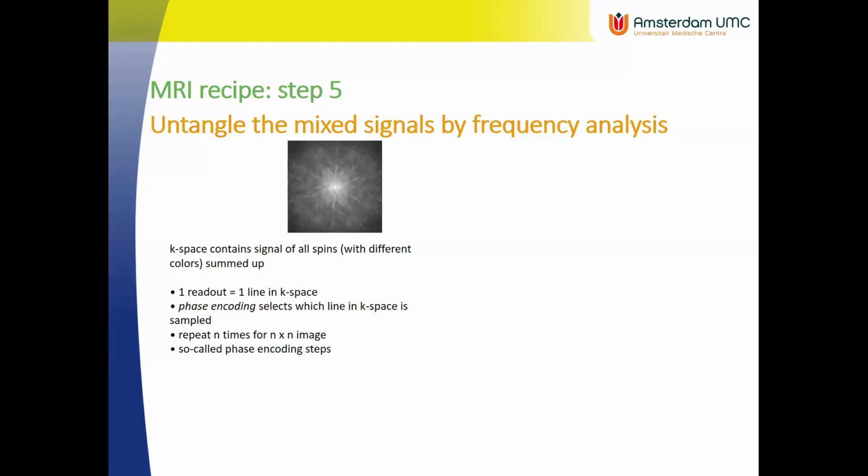So there also comes an interplay with the spatial encoding, the repetition time and the image contrast, obviously, because I need to repeat my acquisition over and over again to get all the information, do the spatial encoding, and I also need the repetition time to create a T1 contrast if I want to have that. So the repetition time comes into play.